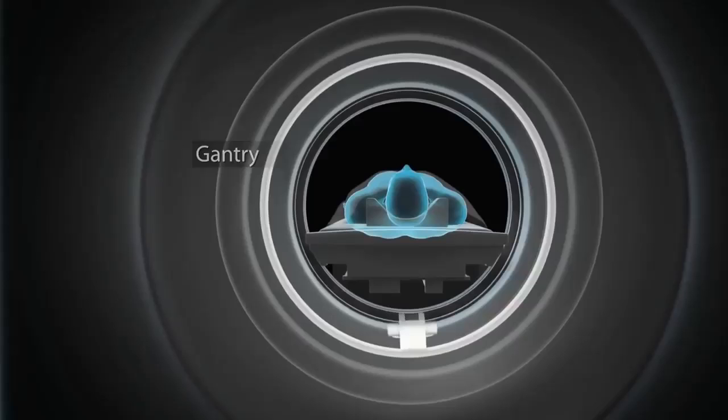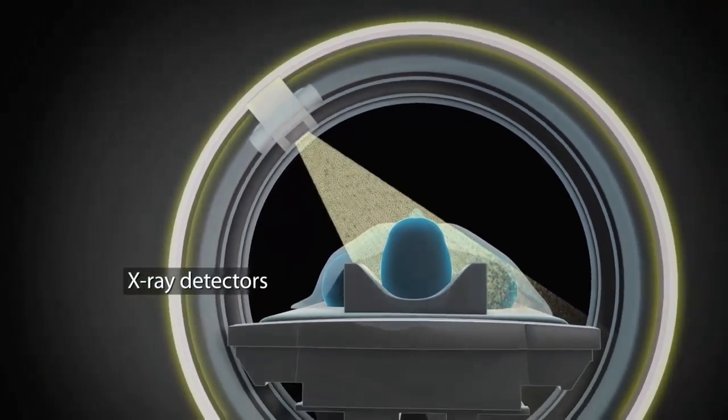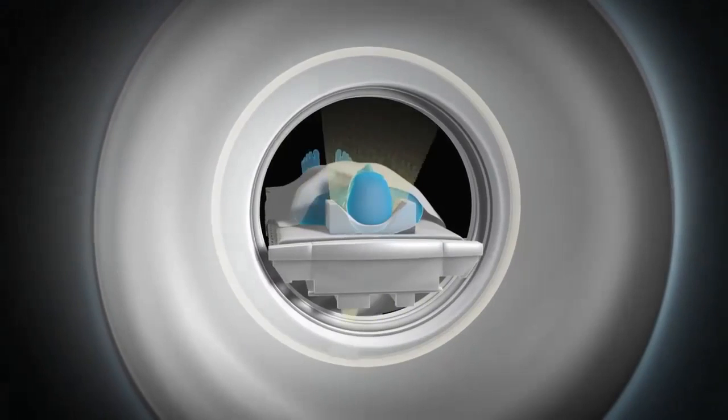Okay, you can see how they take the image. The gantry contains a tube that will release X-ray beams and detectors that will measure the amount of radiation. This one, they just take one slice, like one slice of it. It's like, okay, let me see if I can draw it. It will rotate at different angles, absorbed by your body. The X-ray beams will capture many views of your body.